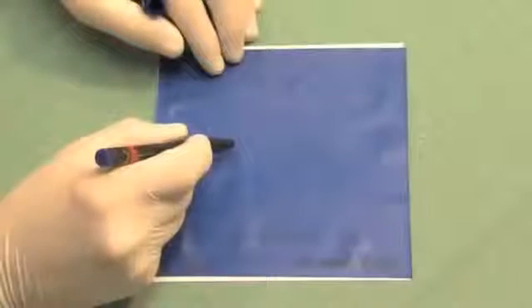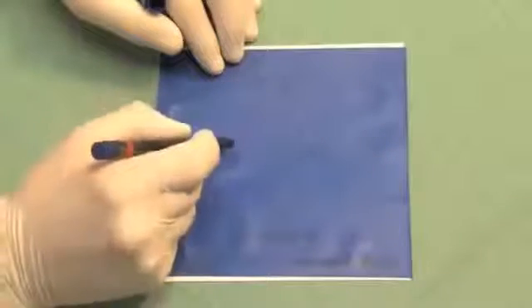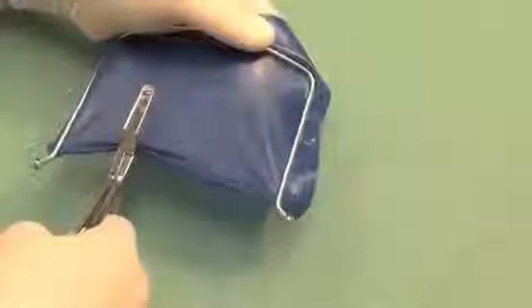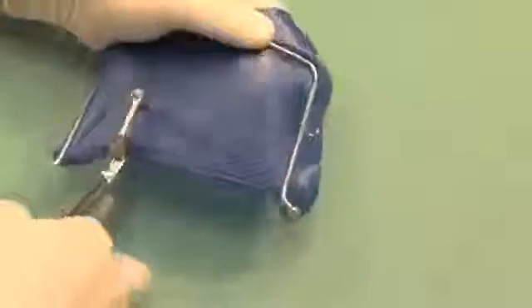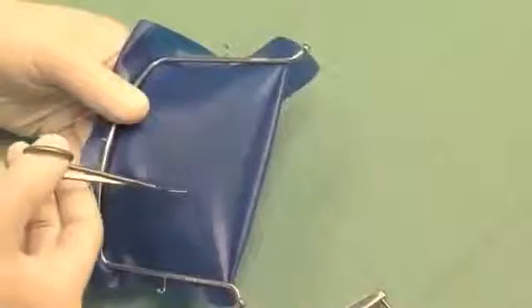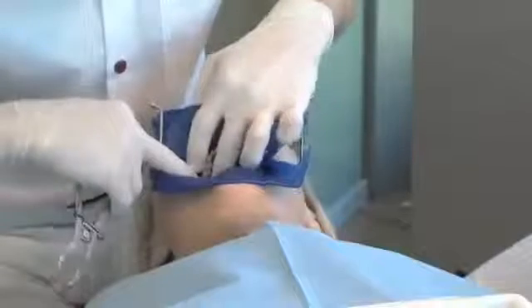Using the rubber dam in the traditional manner, the hole positions are marked using a template. Then the rubber dam is stretched over the frame and punched. The dental arch can also be cut out to give a better gingival overview. The prepared rubber dam is placed over the dental arch and fixated distally by clamps.